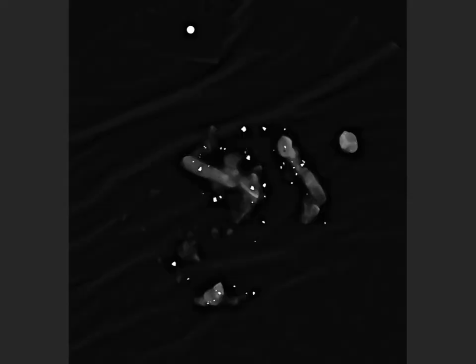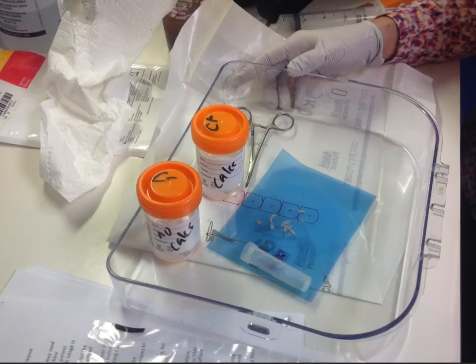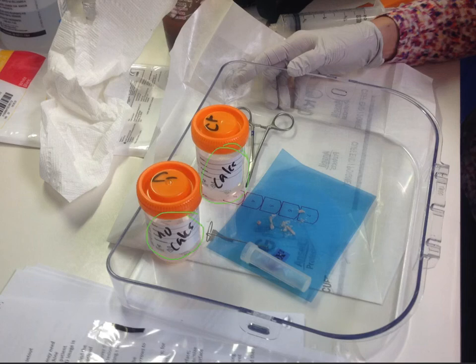So here is the specimen radiograph from our patient. You can see we got a little overenthusiastic. We're inserting our eggshells here so we have plenty of calcifications, not all of them within specimens, but we usually identify for the technologist the specimens which contain calcifications and they put those into a separate pot. So the technologist will use the radiographs to be able to separate out the specimens that have calcifications from those specimens which do not and this aids the pathologist.